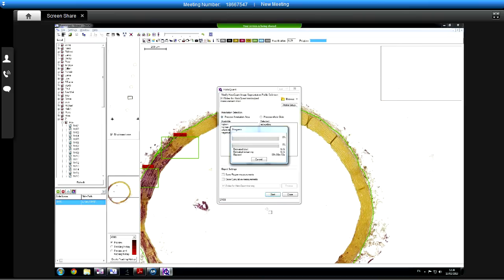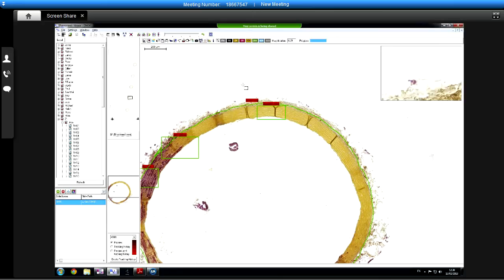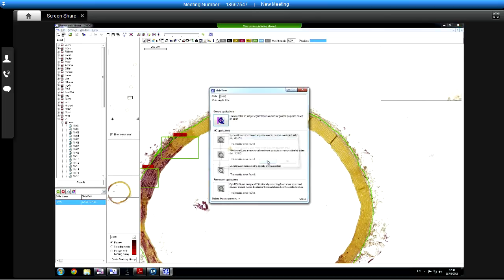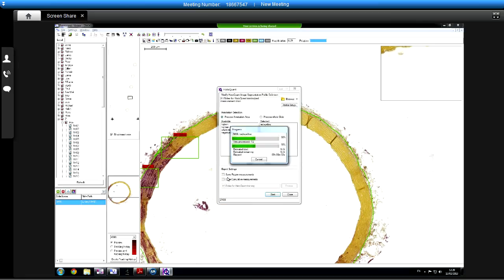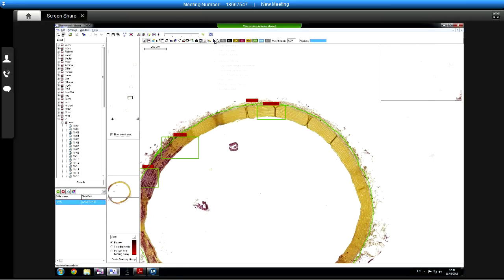I'll tell you what we should do, is delete the existing measurement, because otherwise we'll see one on top of the other, and we won't be able to tell what was from what. If I can't get it to do it, I could maybe just do that to stuff. How many of these samples are you likely to analyse in the long term?